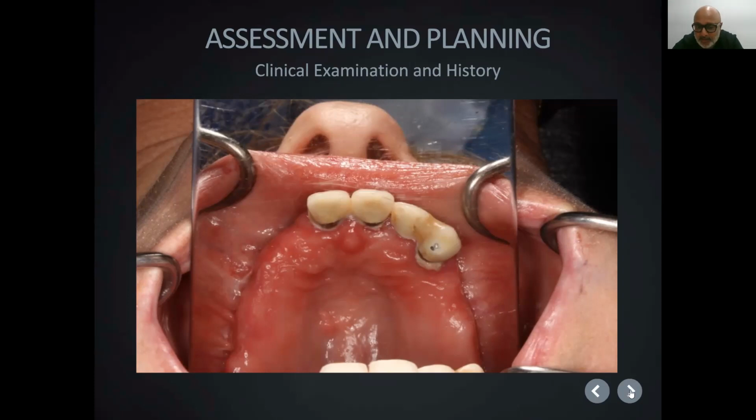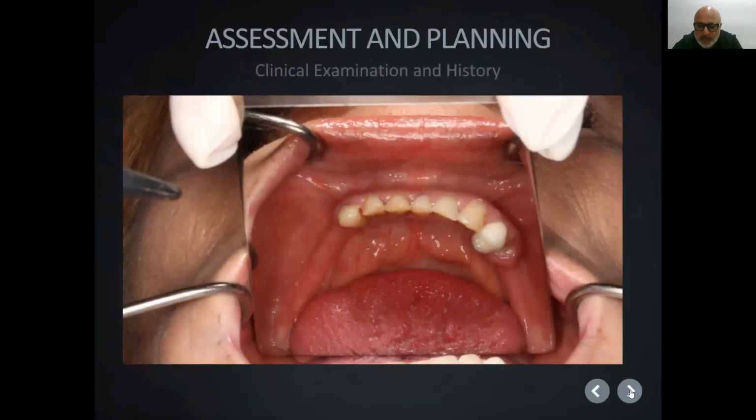And to basically, as a last resort, just to patch things up. This patient did wear dentures. Just looking at the lower, which was in pretty much the same condition. And you can see the shortened teeth that we saw in the X-ray here. And we can also see the flattened ridges.